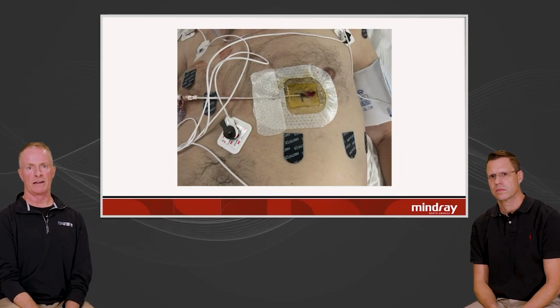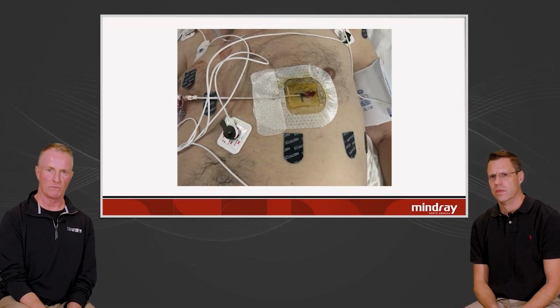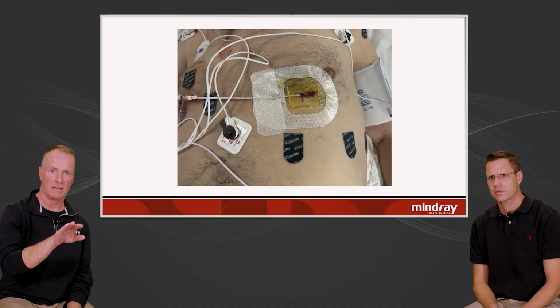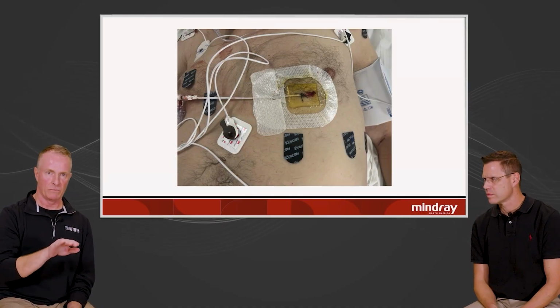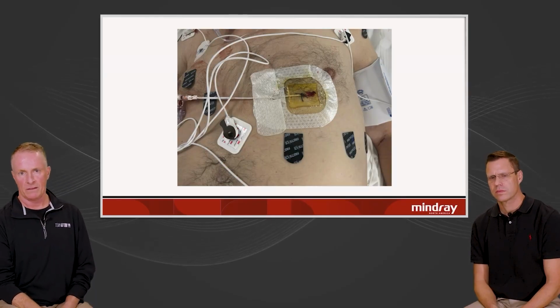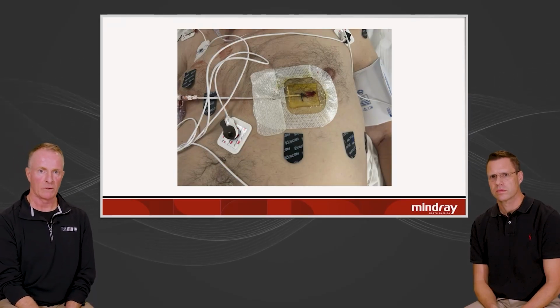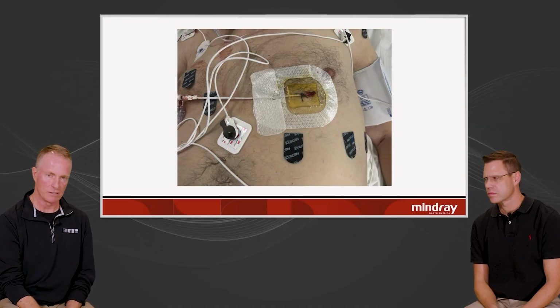And then this is where it ended up in the patient, pretty far out lateral. But you don't really have to pay attention to where you are in the chest wall. Once you see, if you're on top of the pericardium, you're seeing the pericardial effusion. Once you get away from the sternum and that internal mammary artery, don't worry about hitting anything else, because if you can see the effusion, there's nothing else in the way.